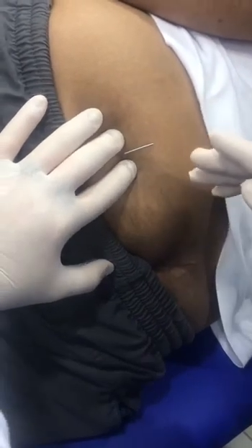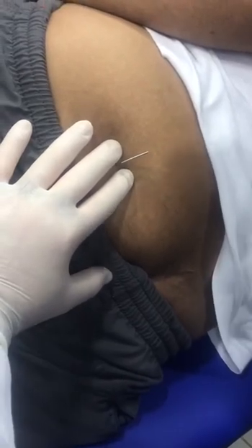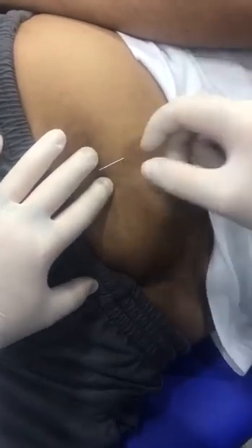What I usually do is that wherever I change the direction a bit, if the first entry is fine, I repeat. Then I go changing.